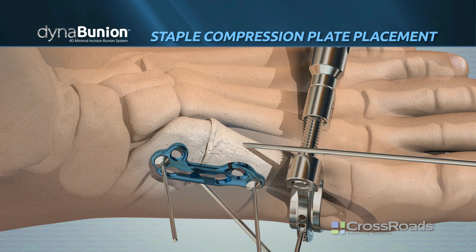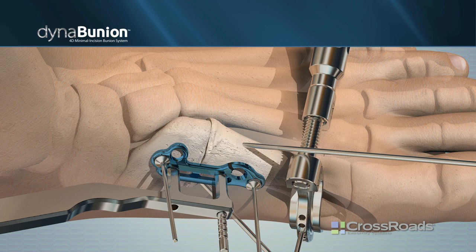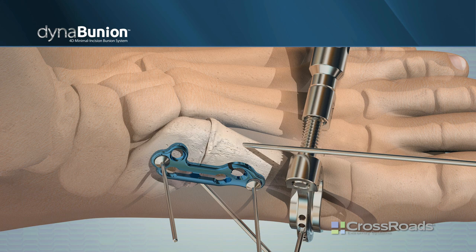Align the 18mm drill guide to the center slot of the plate and use the 3.2mm reamer to drill for one of the staple legs. Place a temporary fixation pin in the prepared hole. Use the 3.2mm reamer to drill for the second staple leg. Remove the temporary fixation pin.